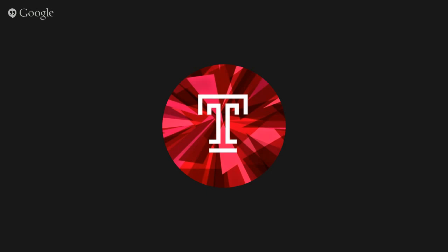So the corresponding MR images now in the axial, sagittal, and coronal plane, look at this nerve. That looks almost like a vessel. It's so bright. Do you appreciate that? It's an enlarged ulnar nerve. All of this is the enlarged ulnar nerve. All of that is enlarged, and a very bright ulnar nerve. That's an ulnar neuritis, in a patient who had multiple intra-articular bodies. The bodies are not inside of the cubital tunnel, they're inside of the joint space, but it was irritating the MCL, causing it to become thickened, and that narrowed the cubital tunnel space, and the patient developed ulnar neuritis secondary to that.